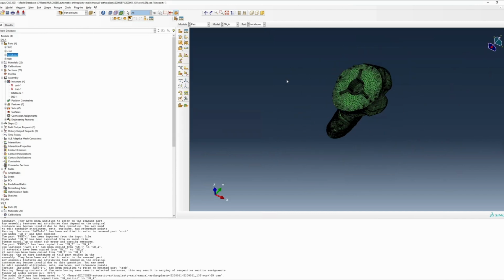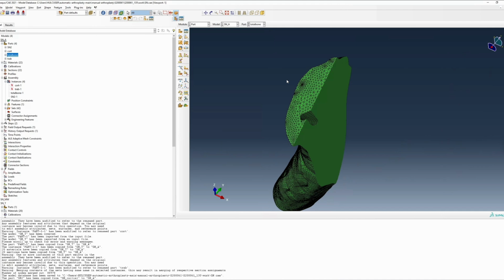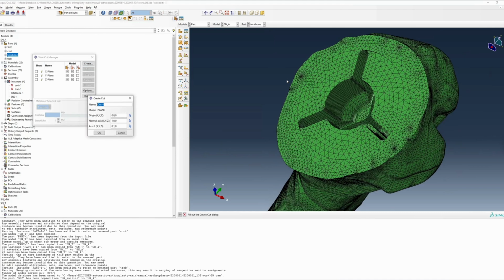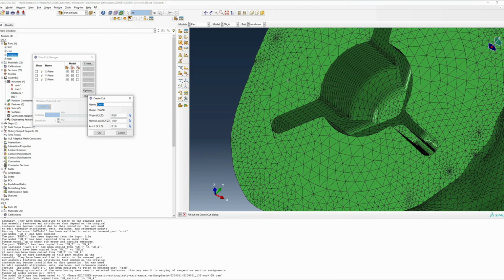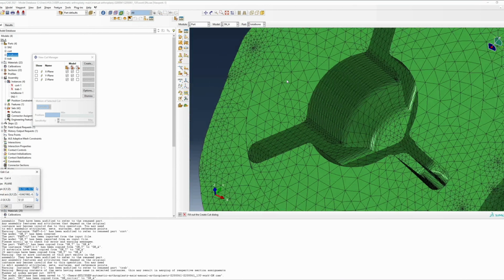This next part is very specific to my own analysis. One of the outcome variables of my own study is risk of stress shielding at the proximal calcar region of the humerus. I want to request a targeted field output variable at this location, so first I need to use the section view and display group tools to create a 2mm by 10mm element set at that region of the humerus model.